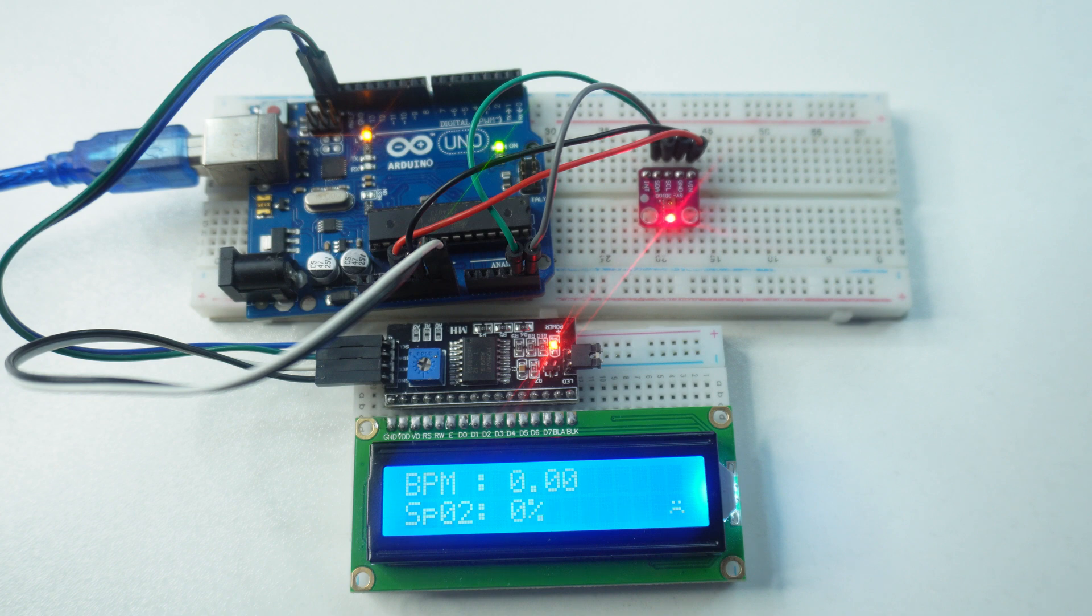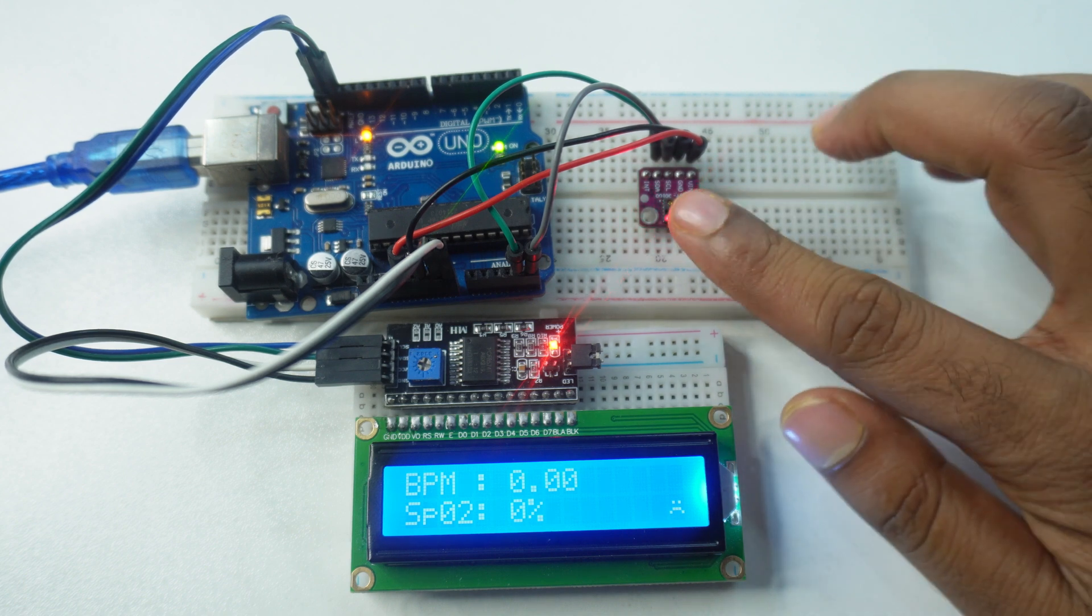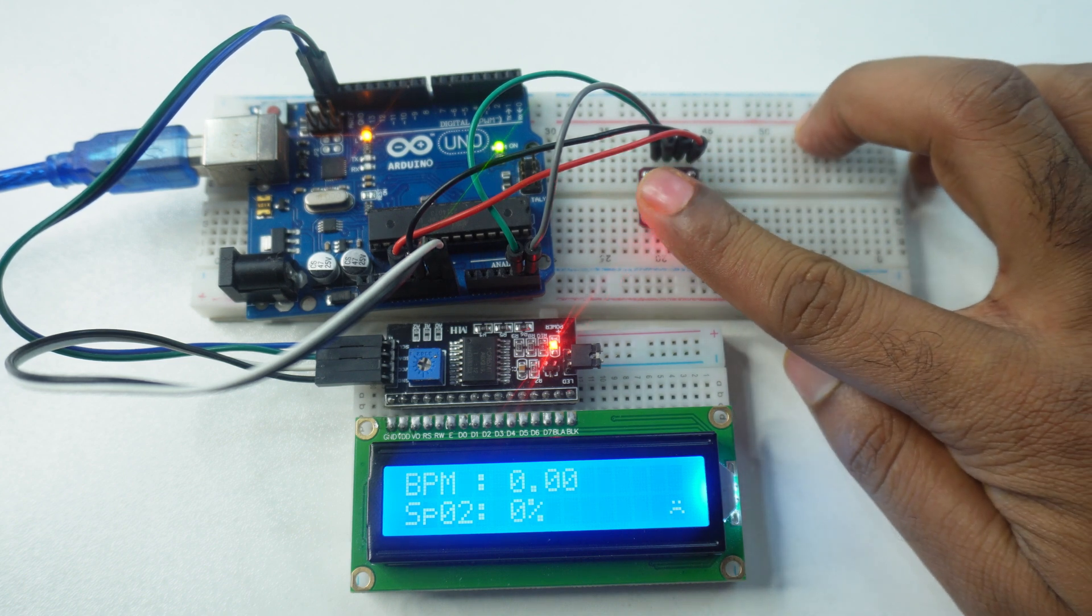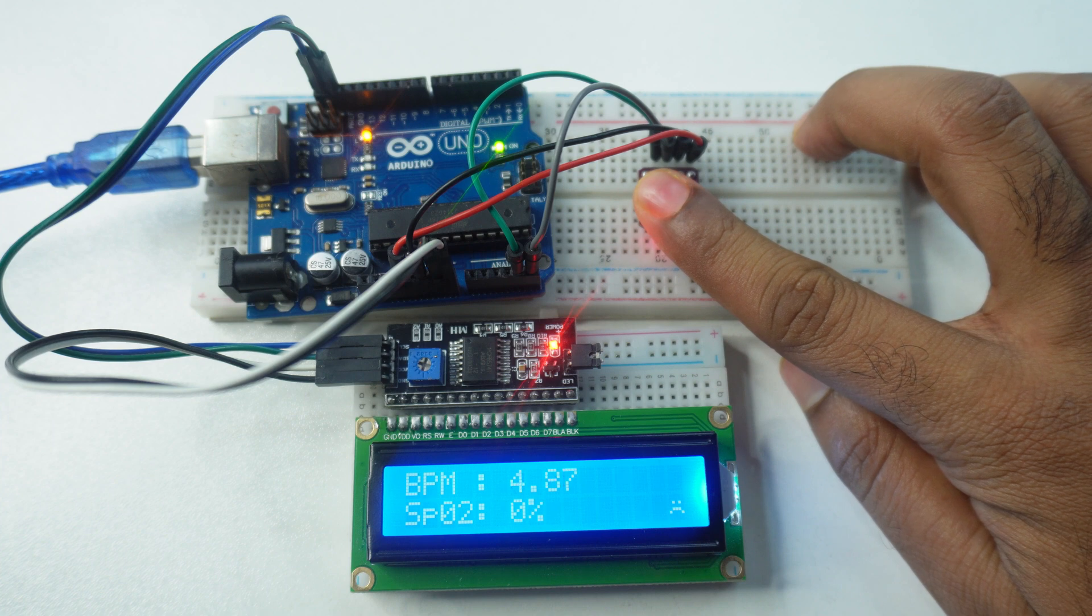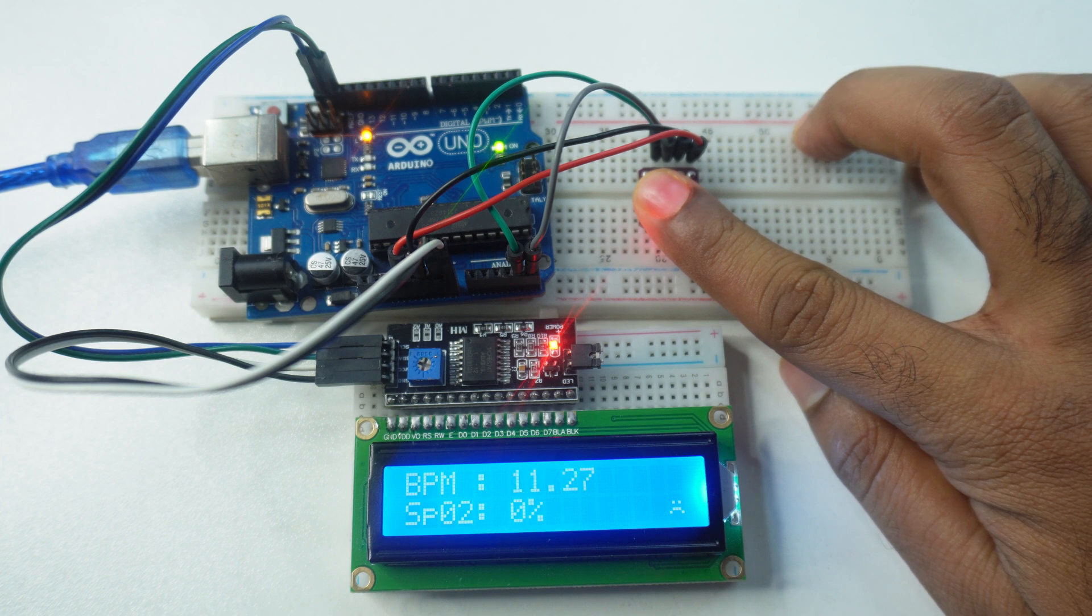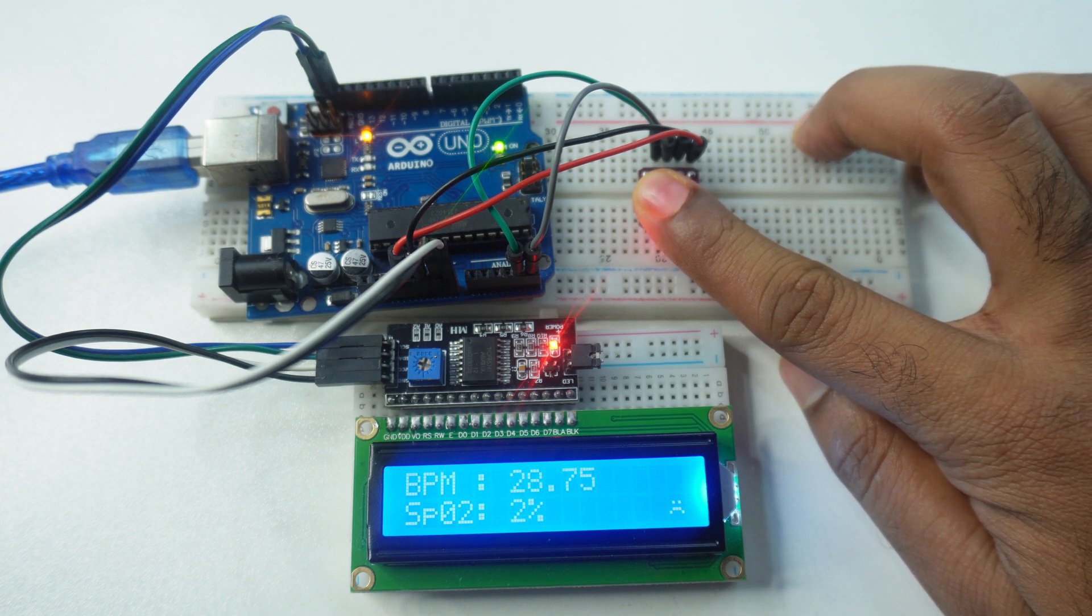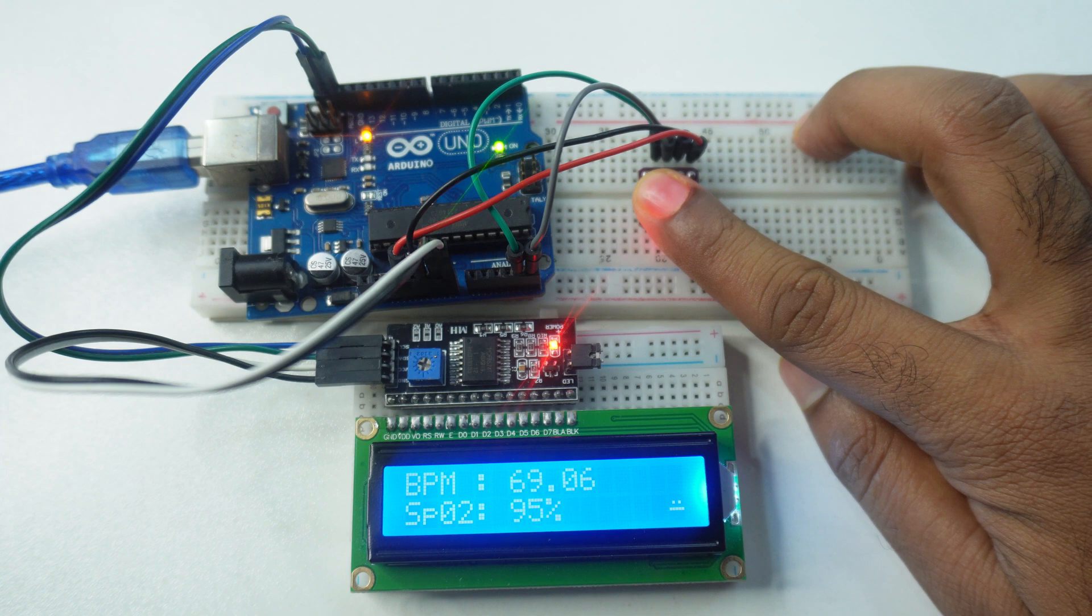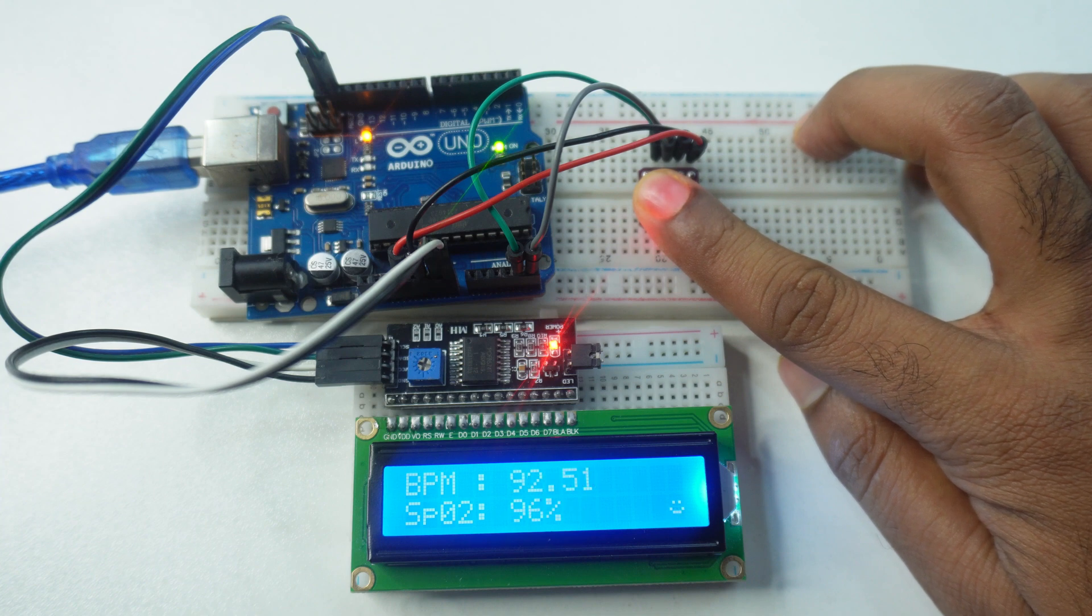Hello viewers, today we will learn how to make a pulse oximeter and heart rate monitoring project using MAX30100 sensor. In a previous video, I have already shown this project using OLED display, but today we will remake it using LCD display. So let's begin.